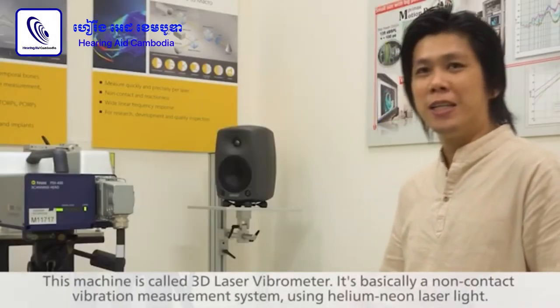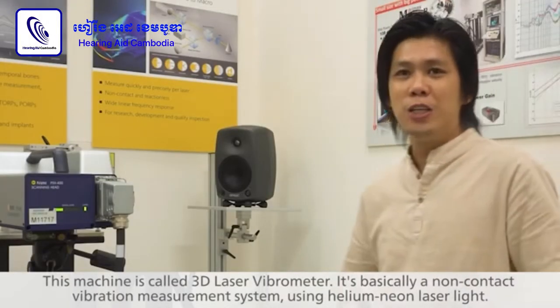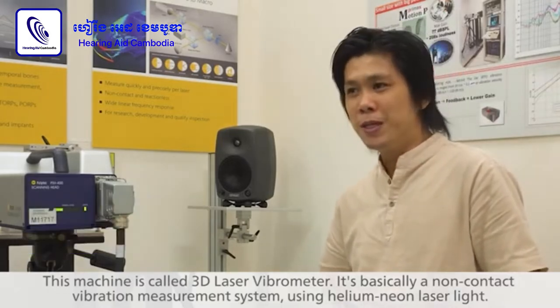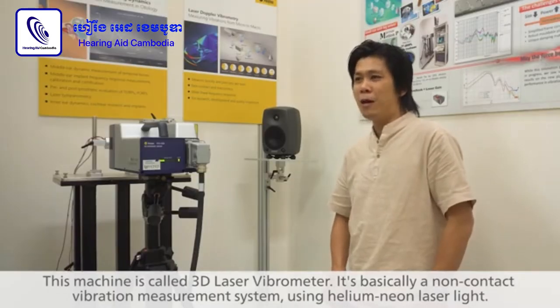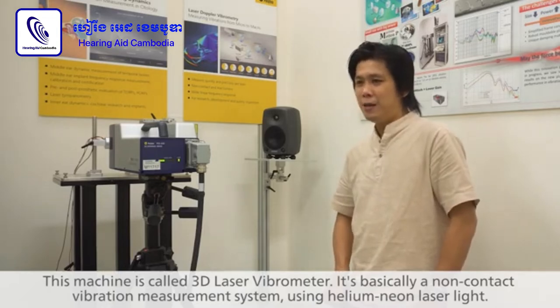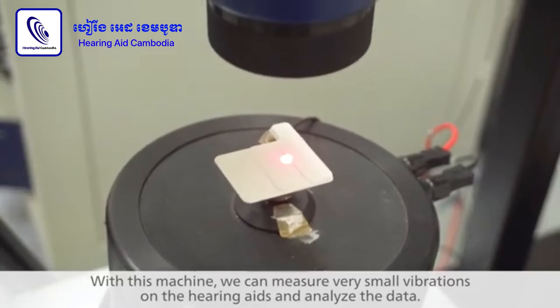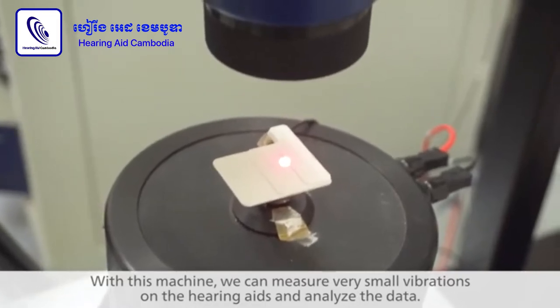We have this machine, we call it a 3D laser vibrometer. This machine is basically a non-contact vibration measurement system that uses helium-neon laser light. With this machine, we can measure very small vibrations on the hearing aids, and we can analyze the data.